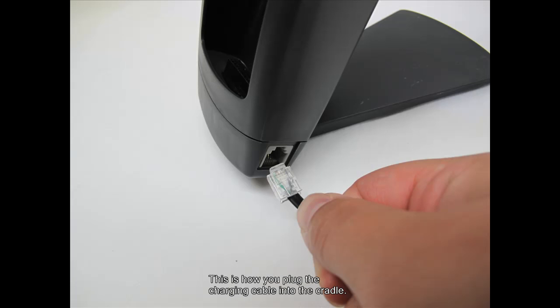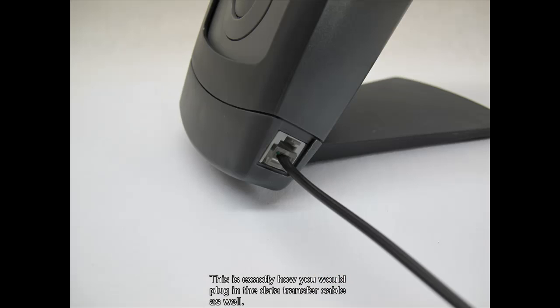This is how you plug the charging cable into the cradle. Note that the locking tab for the connector is on top when you plug it into the cradle. Press the connector firmly into the port until you feel it lock into place. This is exactly how you would plug in the data transfer cable as well. We'll show you that in a later video.